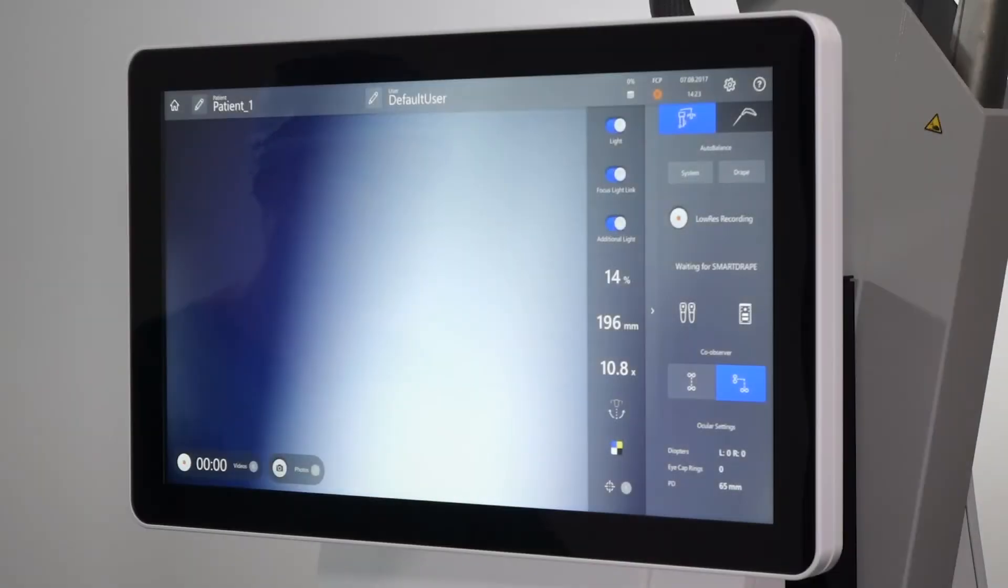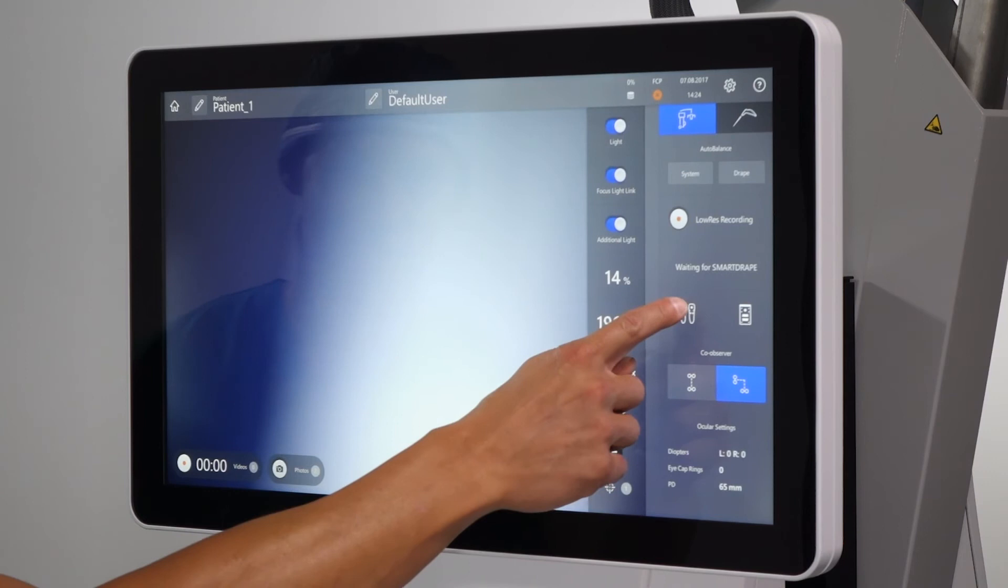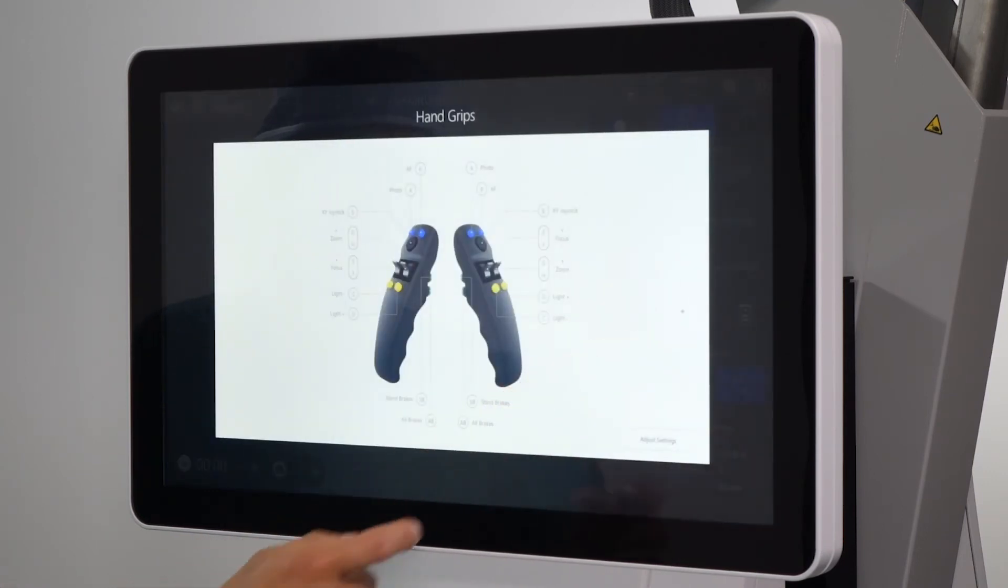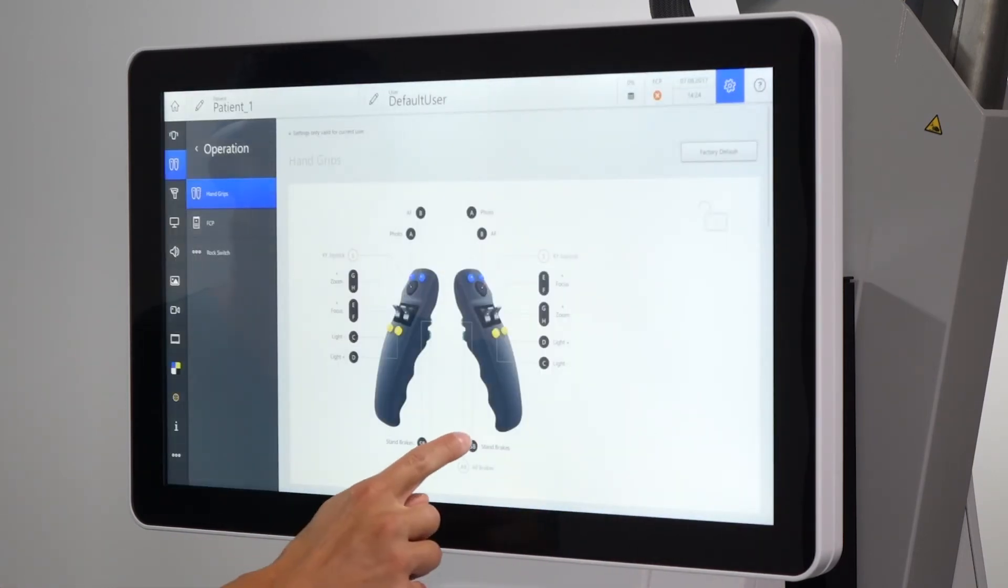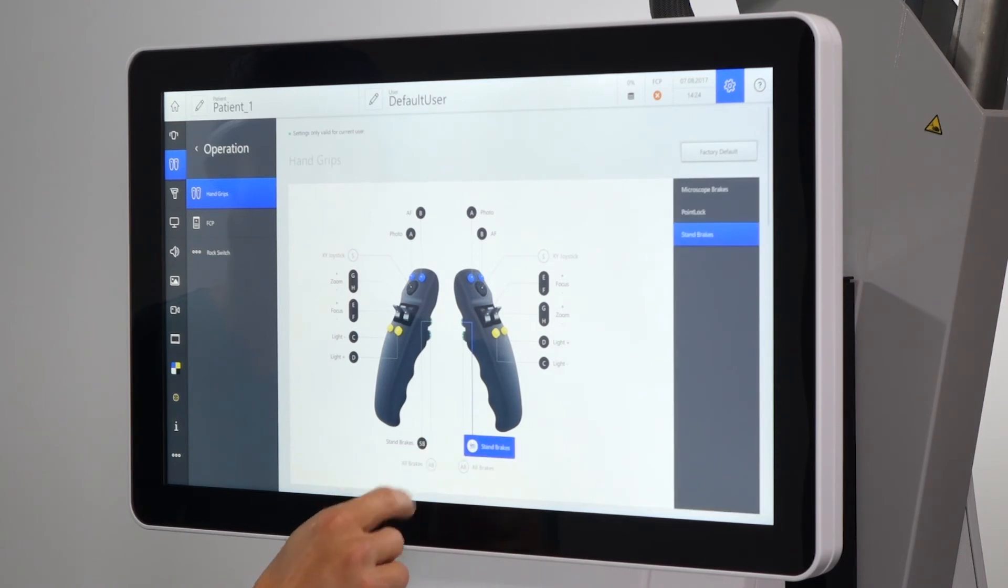Zeiss Kinevo 900 offers a completely new movement mode. Point lock can be activated manually by programming it on one of the upper green buttons.